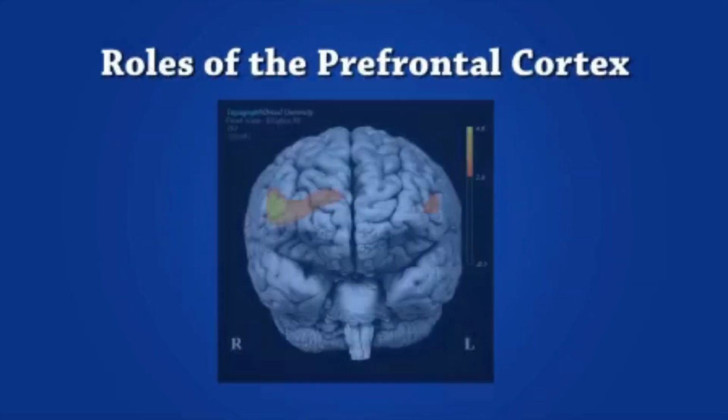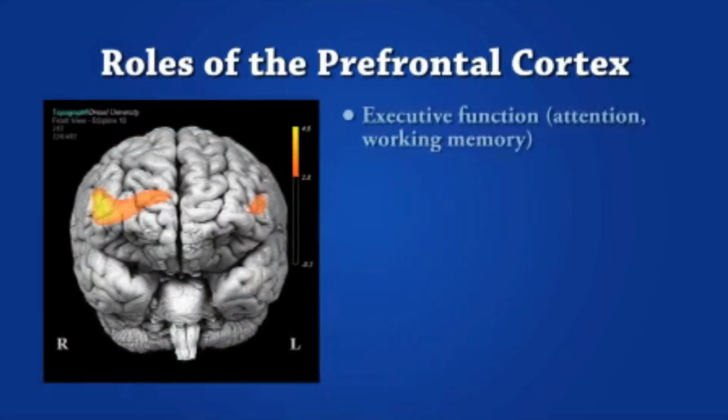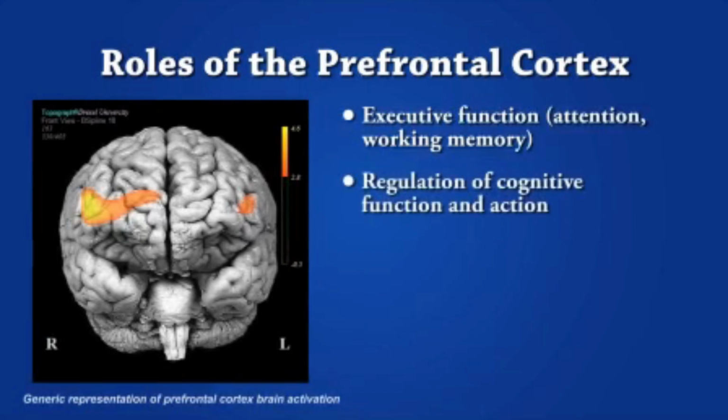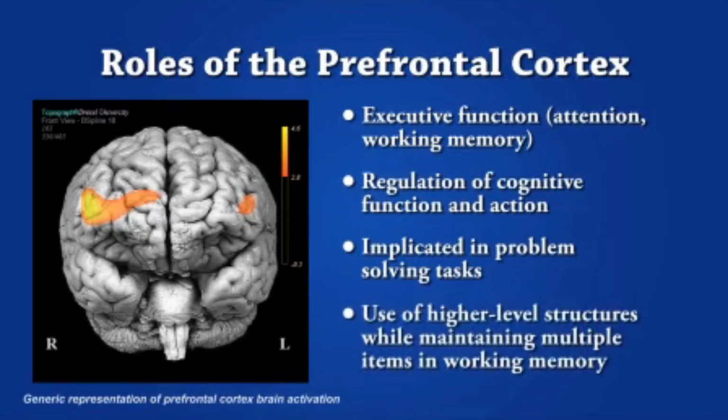Using fNIR and focusing on the prefrontal cortex, we are capitalizing on the function of the PFC, especially executive function, the regulation of cognitive function and action, the use of PFC during problem-solving tasks, and the use of higher-level structures while maintaining multiple items in working memory.